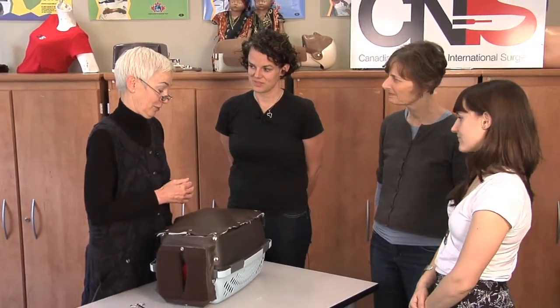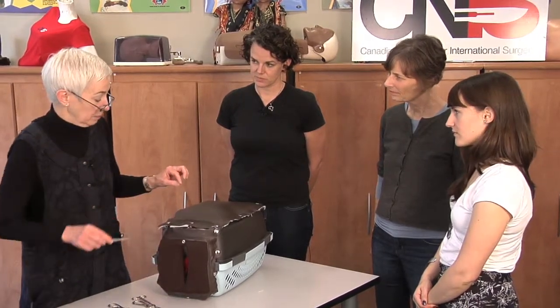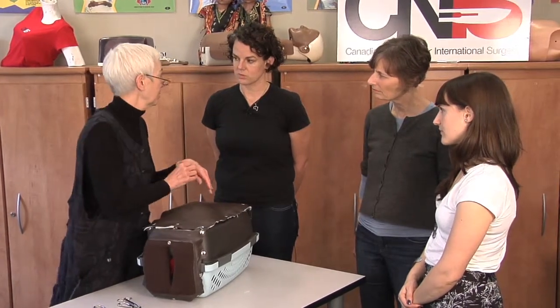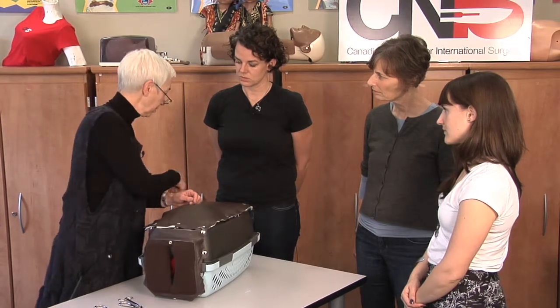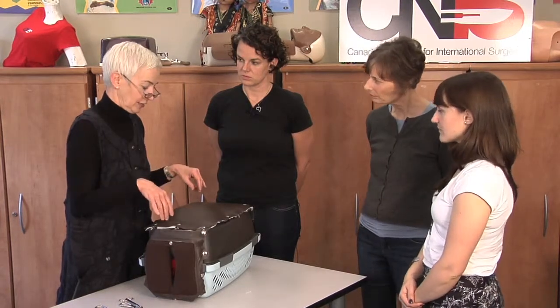There's also an exercise for practicing sutures — we use a goat's foot, which is readily available and easy to find. The student makes an incision and then practices stitching — two different kinds of stitches. They practice interrupted stitches, two different kinds, and then also a running stitch — more like what you'd use when sewing a hem on a dress. So those are the exercises that they do.